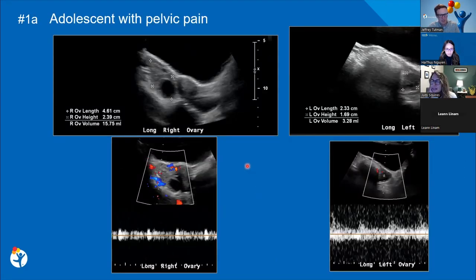Before I forget, it used to be, and I really should look, I'm sure it's been updated, one of the ACR accreditation checklists for pelvic ultrasounds to know the LMP of a patient. So one suggestion that might be helpful is have your tech start putting that on the face sheet for all of these kids, and that might help you with that scoring thing. So I should have mentioned that a couple of slides ago, but yeah, that's what we do.